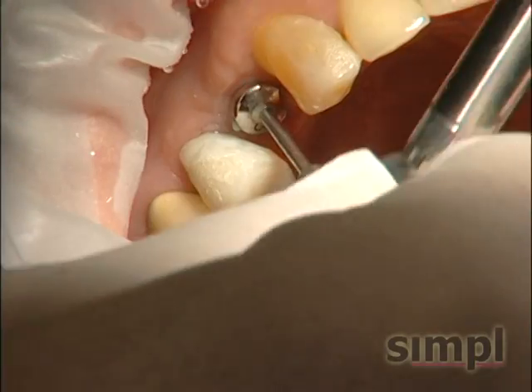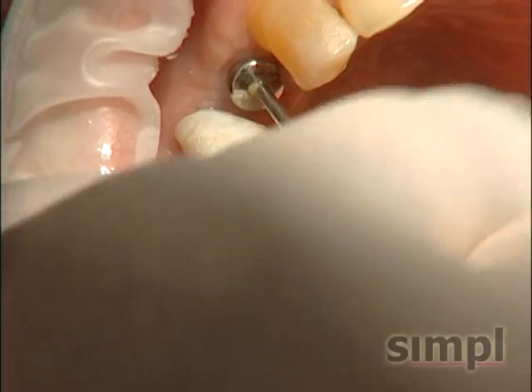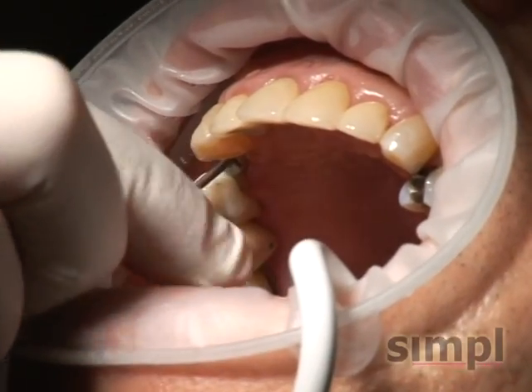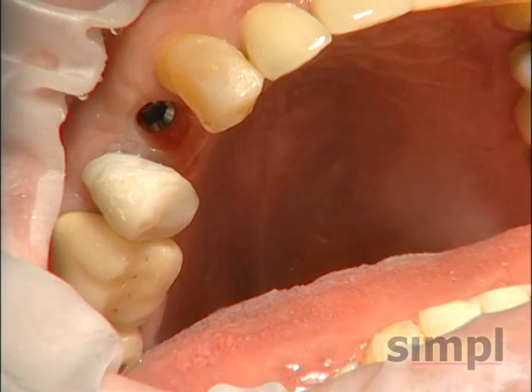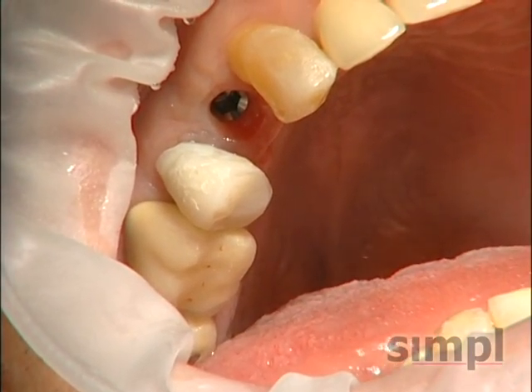Here we are taking off the tissue healing cap. It's been in there for about 3 or 4 months. How nice the tissue is healed. Okay. Impression coping, please. Do you see the site now? Put it back on. Okay, you see it pretty well.